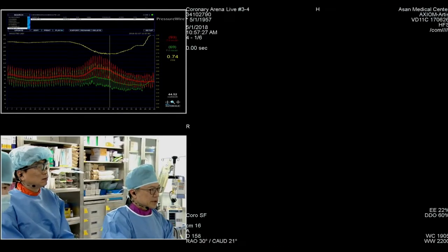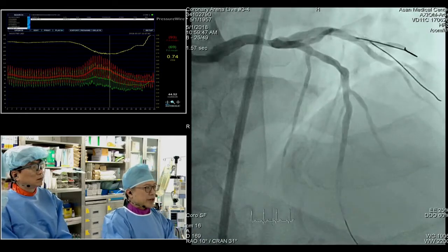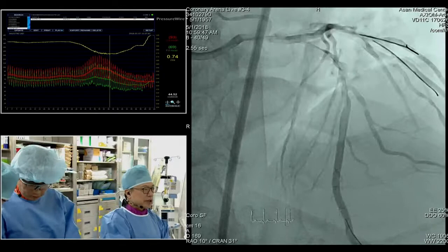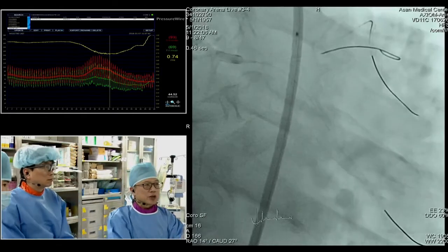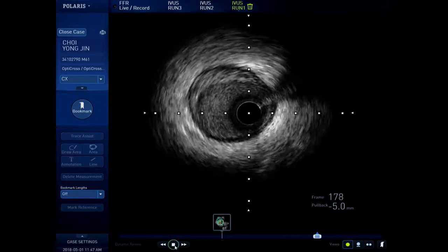Next. I think that's all we have. And Dr. Lee has expertly wired them all and also has performed intravascular ultrasound in all 3 branches, the circumflex, the Ramus intermediate, and also the LAD. So maybe we can start with the circumflex? Yeah. Circumflex IVUS.